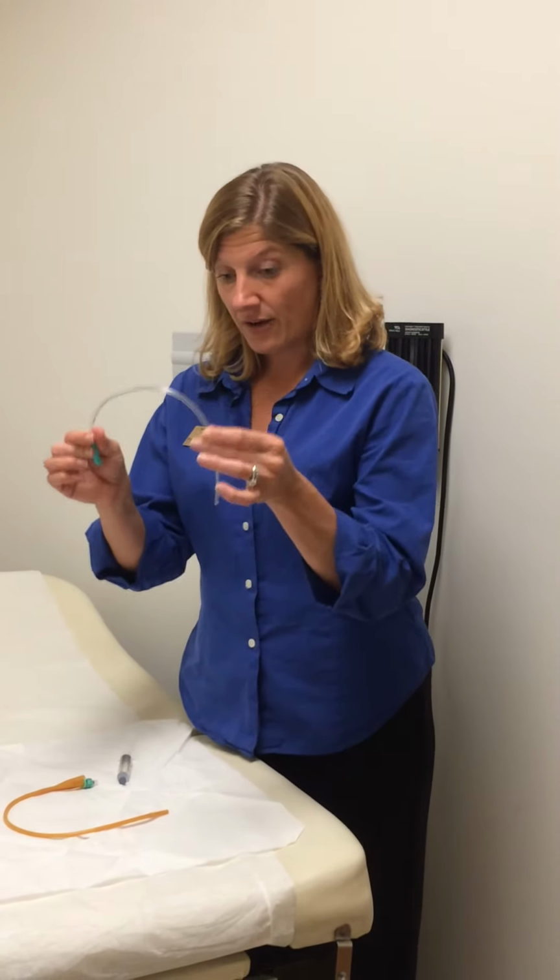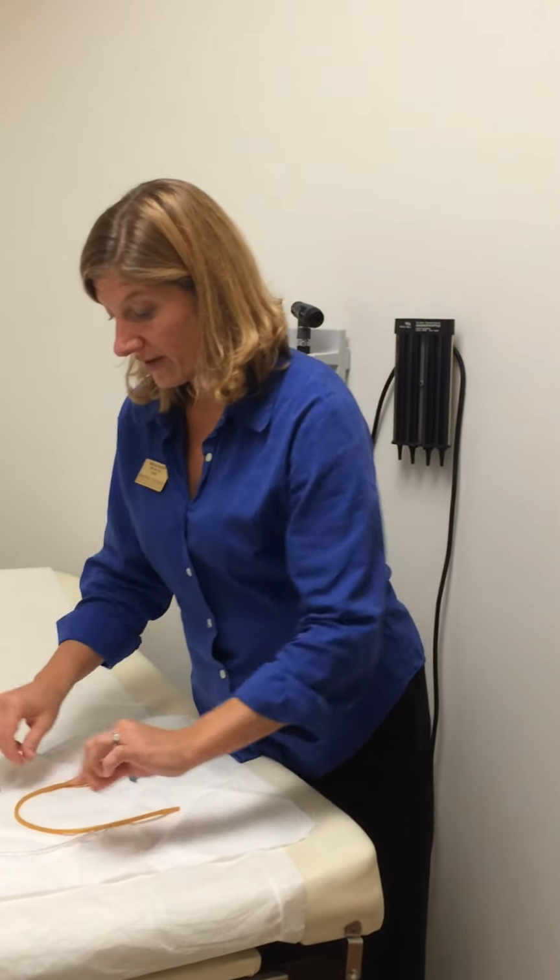After holding it in place for roughly 5 to 10 minutes, allowing the bladder to completely decompress and drain, you will just gently slide the catheter back out and dispose of it properly. Now, that's the straight catheter or the intermittent catheter.